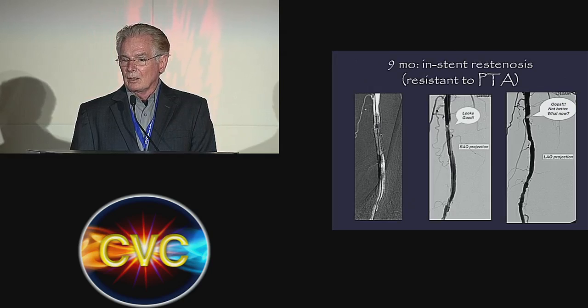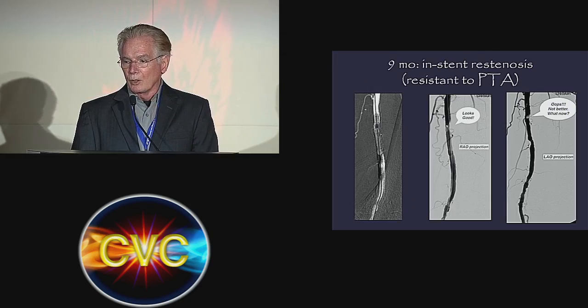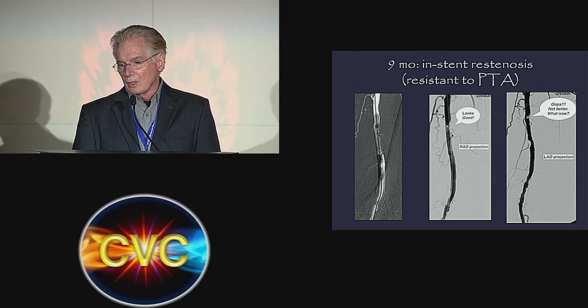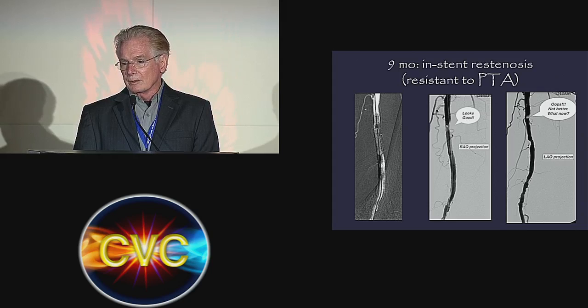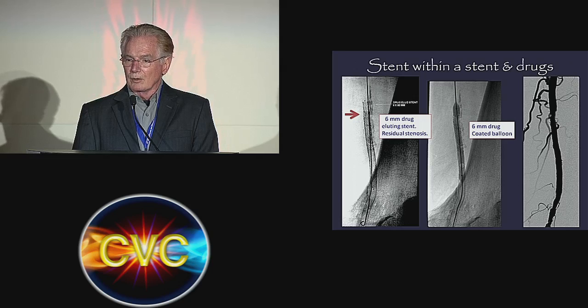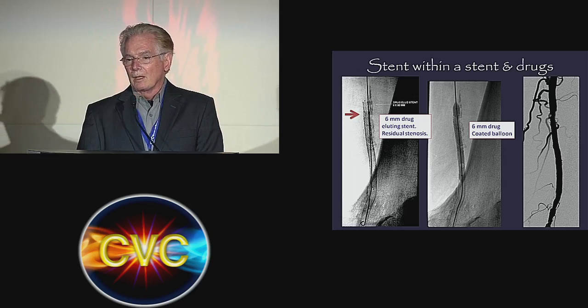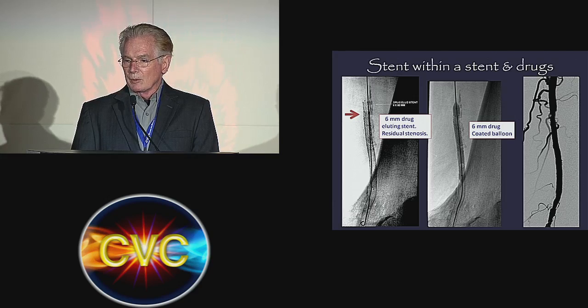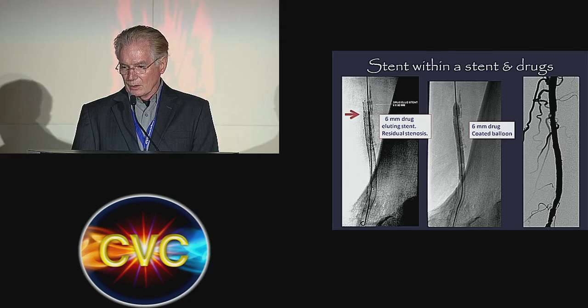And so we did angioplasty. It looked pretty good in the RAO projection, LAO no. And so what do you do? As an editorial remark, I think the best thing would be to really laser it, and then probably use a drug-coated balloon. But that takes time. Or Dr. Matarjami might use a Viabahn. At any rate, what we chose to do is put a drug-eluting stent in, still some stenosis where the red arrow is. So just on intuition, since this guy's already had 3 procedures, we thought for the long term we would use a drug-coated balloon and see what that would do. Gave a nice initial result.